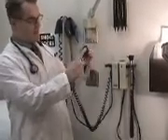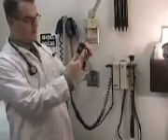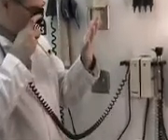To adjust for your own specific vision, there is a dial on the ophthalmoscope that you can turn, look through it, and adjust to your own ability to see. And once you're done with it, it can be placed back here. Also on the same wall is the otoscope, and this also generates a light source once taken off the machine.